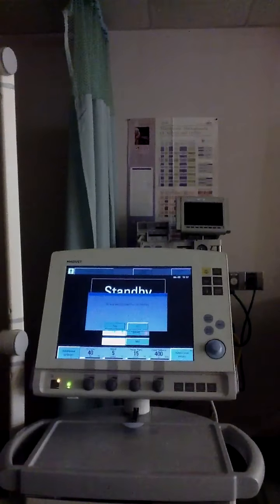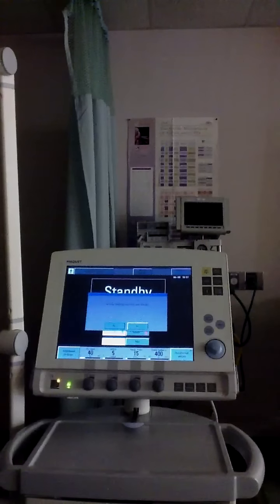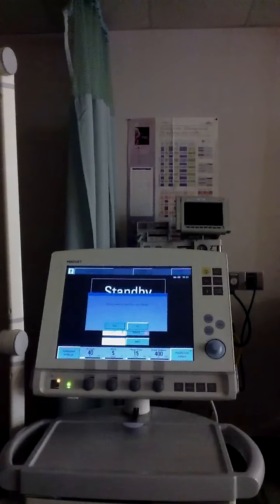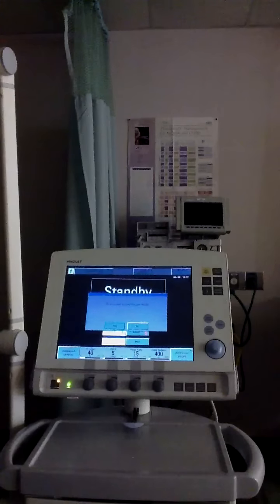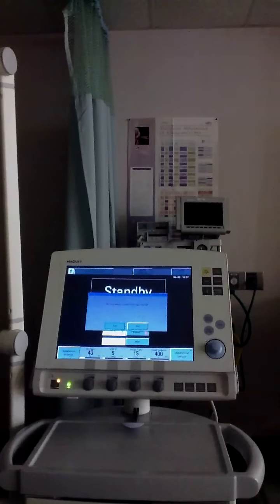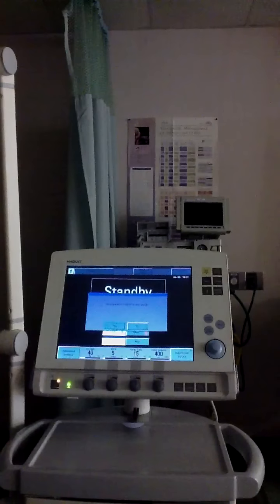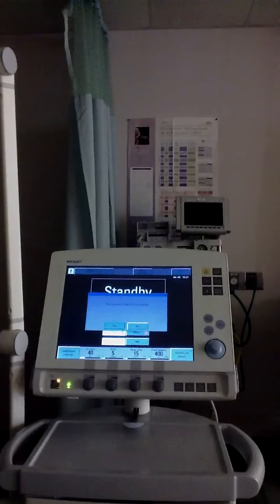Hello everybody, this is Chris back again with the Ancient Scholar. Today I'm just going to go ahead and go through an actual setup of a ventilator and kind of take you guys through what we're actually looking at in the lab for initial setup. So here's a situation — we'll just do a scenario and take it all the way through.